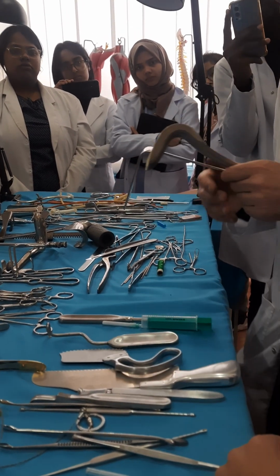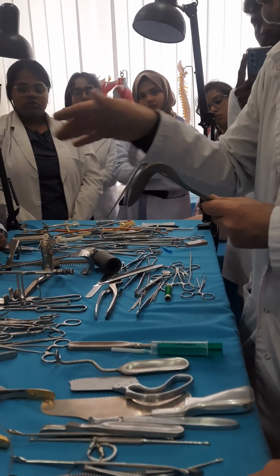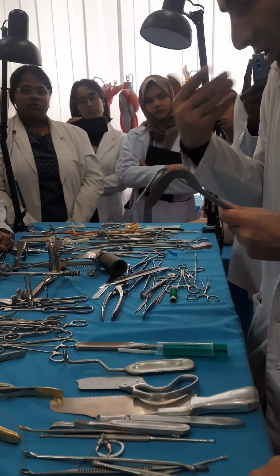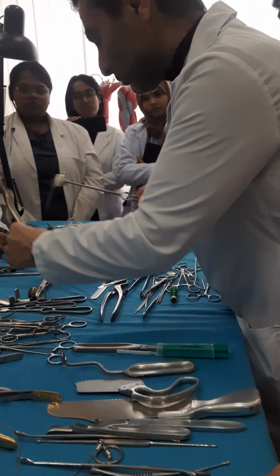The biggest one, by the way, I don't have, we call the liver mirror. Why mirror? Because you don't only apply it, you apply instruments on the body of it, so as not to touch the liver. And you can see your face. That's a liver mirror.